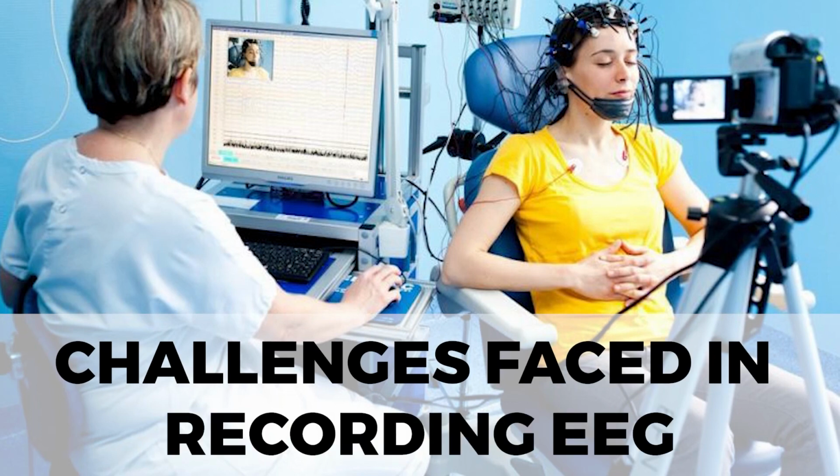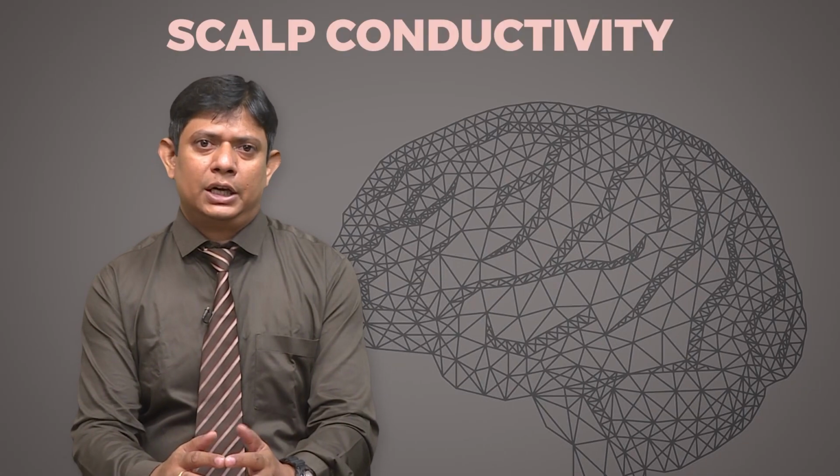Now, the challenges and considerations we face while recording EEG. The first is scalp conductivity. The conductivity of the scalp, skull and brain tissues influences the propagation of the electrical signal. The skull acts as a barrier, distorting and attenuating the signal. Different tissues have different resistance, affecting the recorded signal quality.